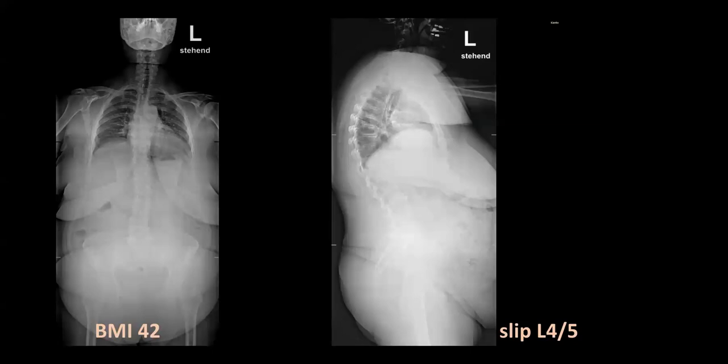So this is so hard to identify here. I don't know whether you can examine L4-5. I can zoom in a little bit. So this is a little bit zoomed in, and you can see a slip at L4-5 very easily. And the BMI is 42. I guess it's not really 42. It's a little bit higher. But she said that no, this was her actual weight. Maybe it's 45, 48. So my question to the audience, what are you doing in a case like this?